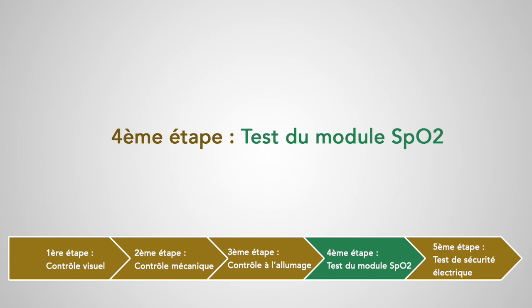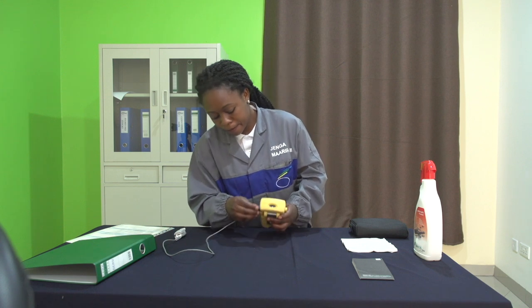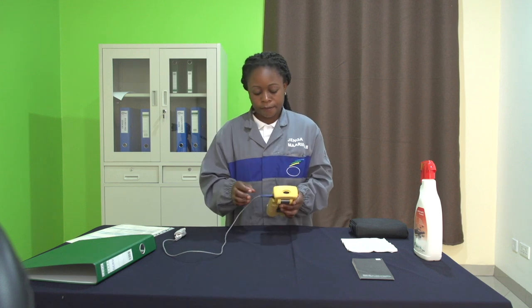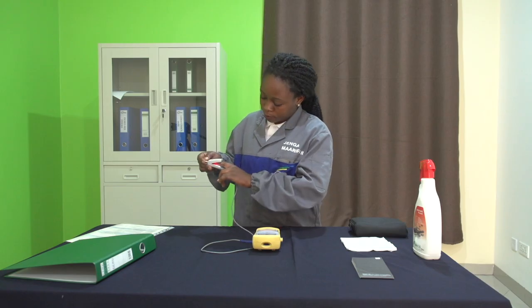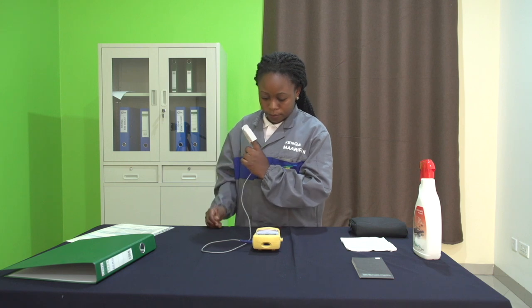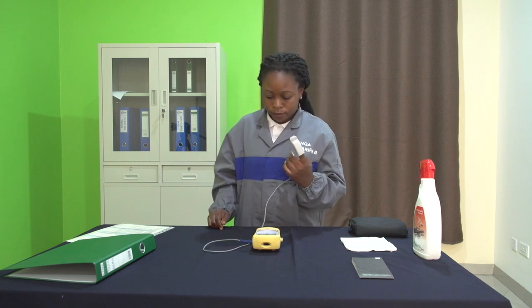Quatrième étape : test du module SpO2. On va commencer par brancher notre capteur et vérifier qu'on a bien une lumière rouge qui apparaît dans notre capteur. Ensuite, on va placer la sonde sur notre doigt et vérifier que les valeurs de la SpO2 et des fréquences cardiaques s'affichent sur l'écran et se stabilisent.